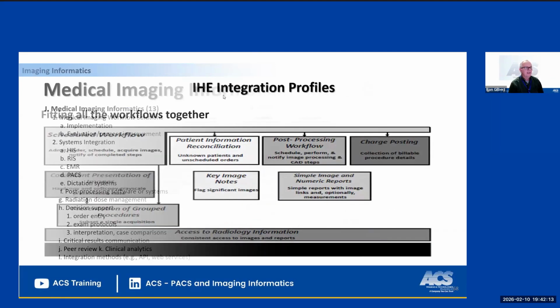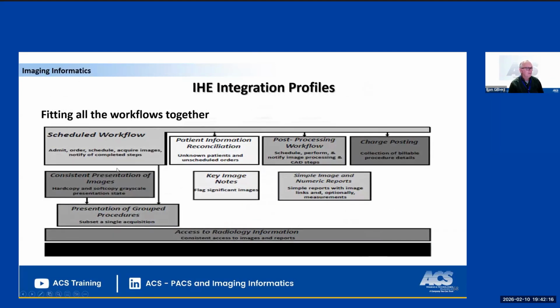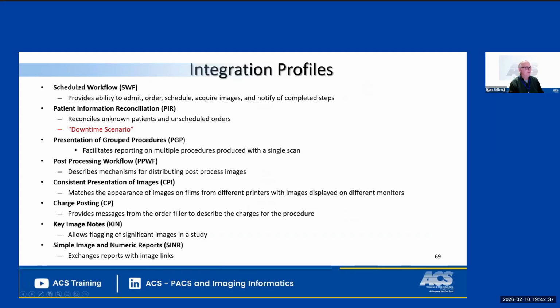All right, and then you have the integration profiles. That's what I was telling you about: you're going to have to understand the workflow and why one computer system knows what the other computer system is talking about, because the programmers wrote it that way, and they use the IHE profiles as a starting point for that software and that programming. That's every step of the image lifecycle. Then these are the integration profiles that are part of the IHE. So this is very good test material right here, so it's important to learn that. But when you understand what each of these is trying to do, it becomes very clear how the system works.